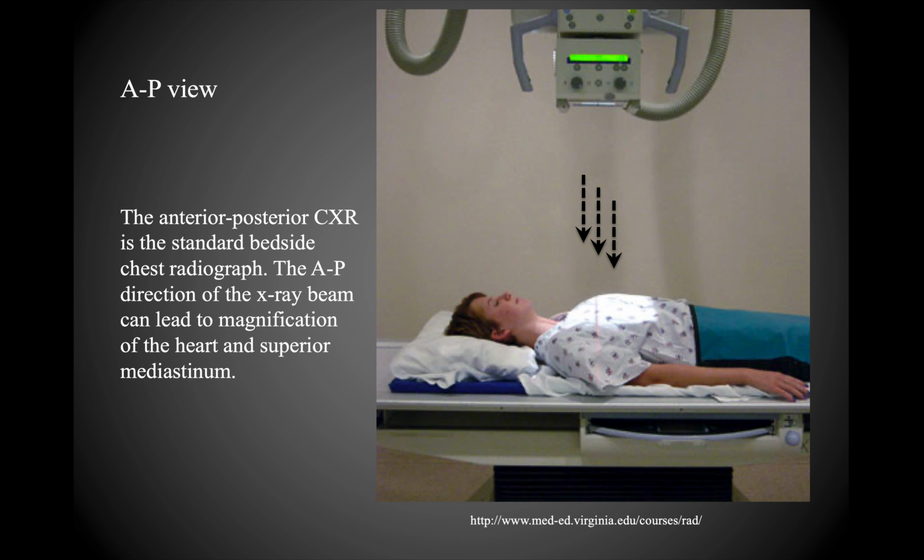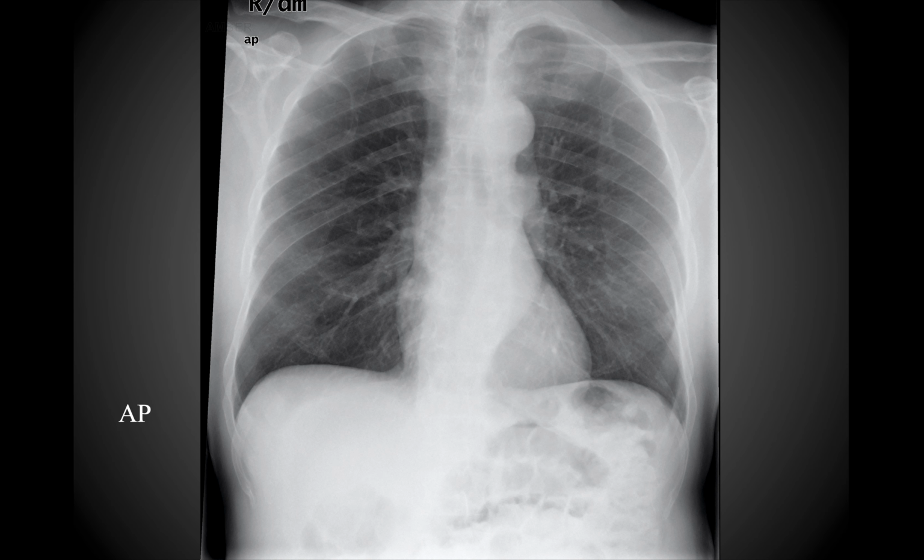So again, going back to the AP view, remember this is usually done in a supine patient. So you can see the x-ray beam sending x-rays through the patient anterior to posteriorly, and then hitting the detector here below the patient. One of the key points to remember with an AP x-ray is that it's going to magnify the heart and the structures of the superior mediastinum. So it's not the standard for trying to measure or determine whether a patient has cardiomegaly.